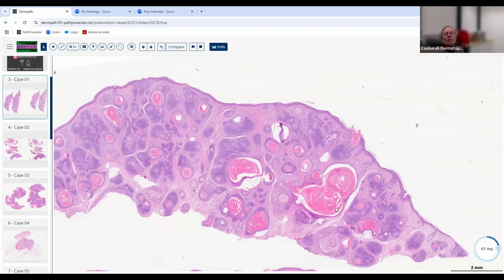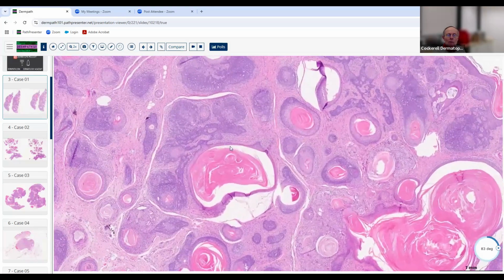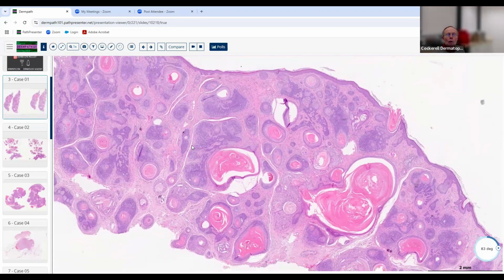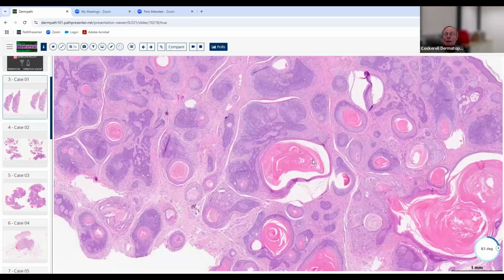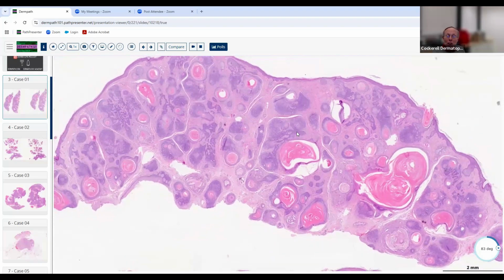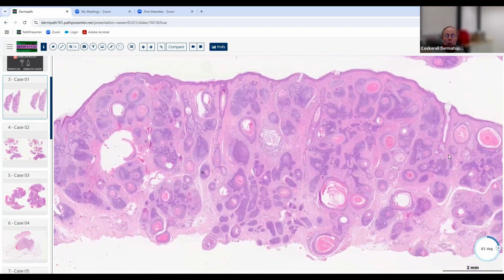But they might put on there a trichofolliculoma, okay? And so you might start looking at this and say, well, hey, there's a little cyst here, and there's a little radiating follicular structure from the little cyst here. And that's what we have learned, reading our textbooks, that you can see in a trichofolliculoma. So maybe I'll put that down. Well, don't be fooled, because that's just one small focus within the remainder of the entire lesion that looks like a classic trichoepithelioma.